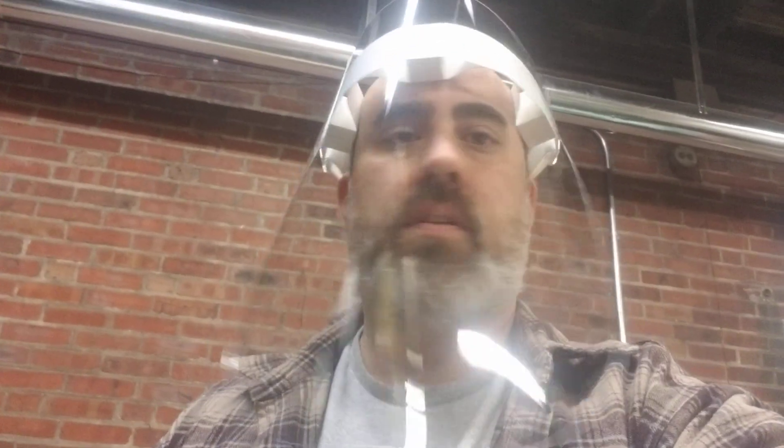Hey, this is Chris at Vanobom. I wanted to show you how the face shield works. It fits on nice and tight. Took a couple seconds to laser cut.